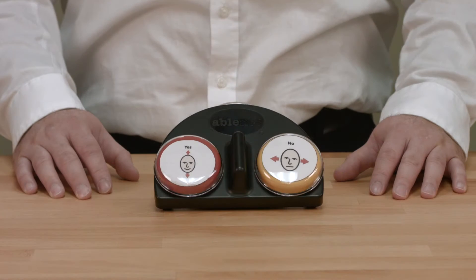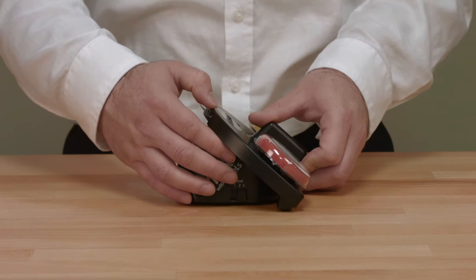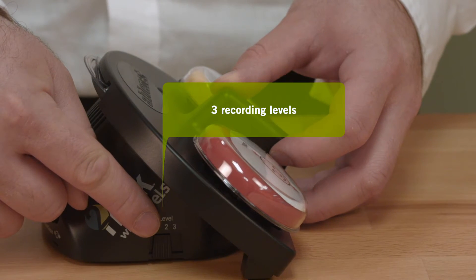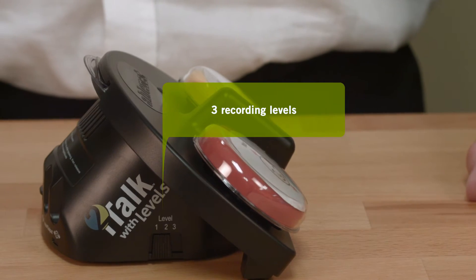The iTalk 2 with Levels features three recording levels. These levels enable you to record three separate sets of messages with a total record time of four minutes to the device and then use them as they are needed throughout the day.